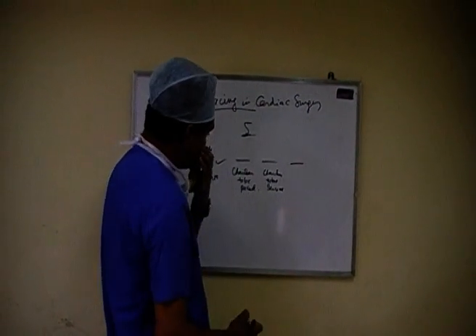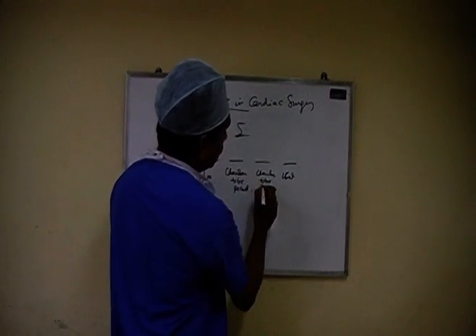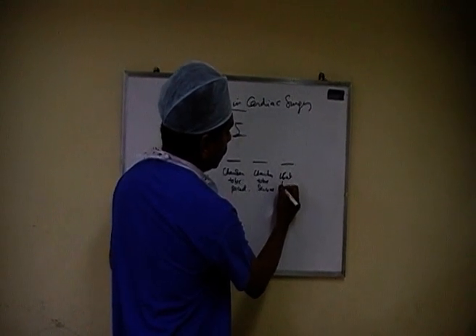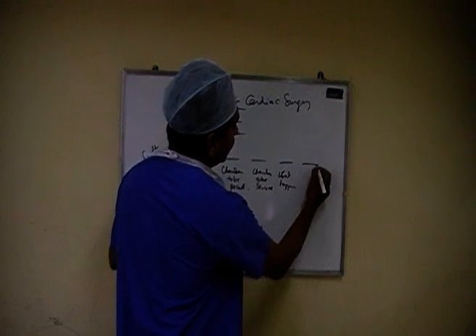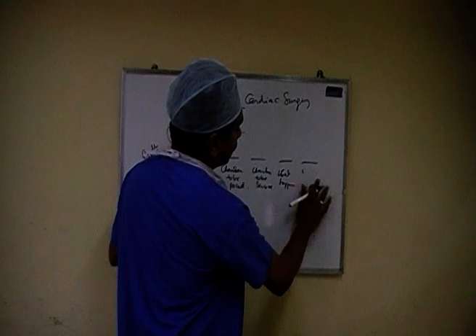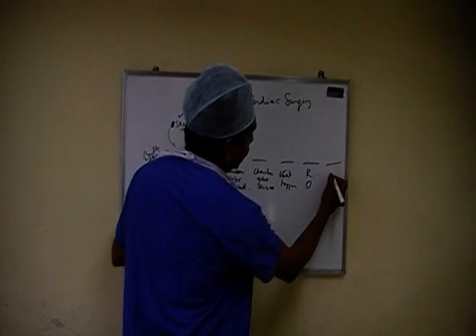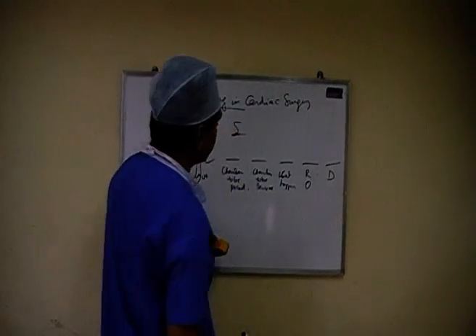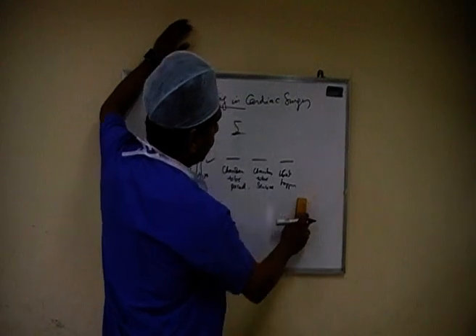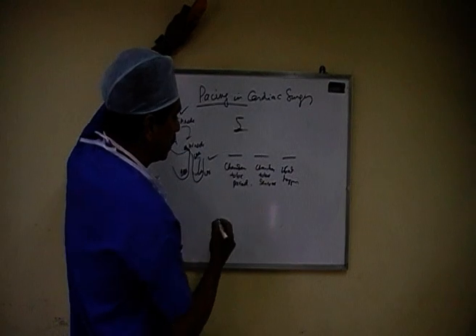Third one is what happens once the box senses the activity, and very often there is a reactive response. And then there is usually a fifth one for defibrillators. Now, usually we don't care about these, and we only talk about the three in routine terminology.